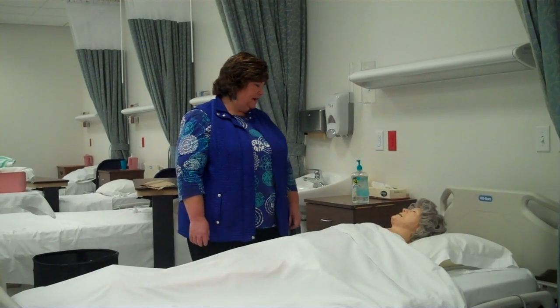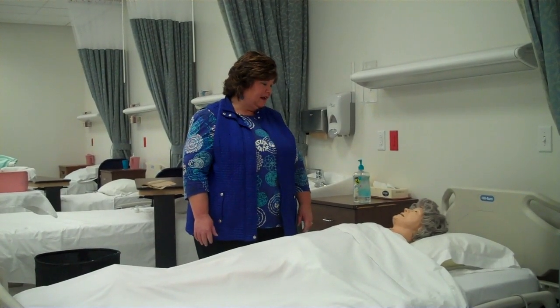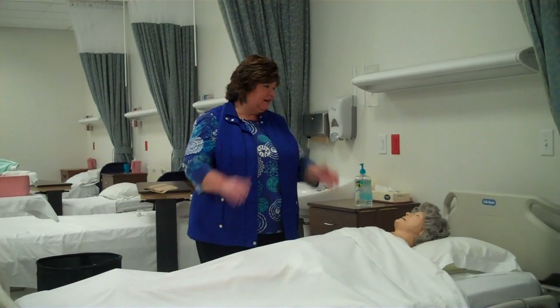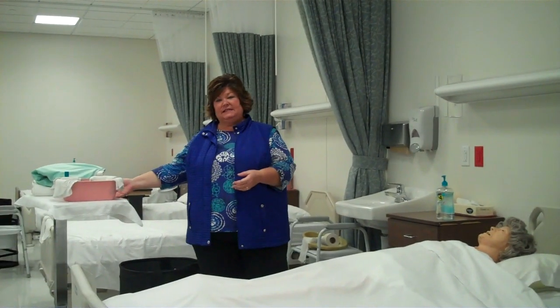Knock, knock. Hi, Mrs. Smith. My name is Barb. How are you today? I'm your nursing assistant and I'm going to help you wash up between your legs and we're going to clean your catheter up really good. First thing I'm going to do is wash my hands and gather all my supplies which I have on the table.